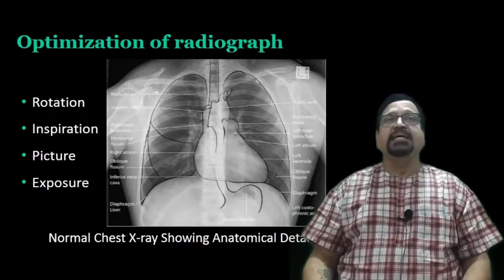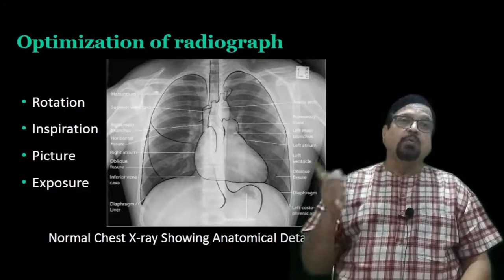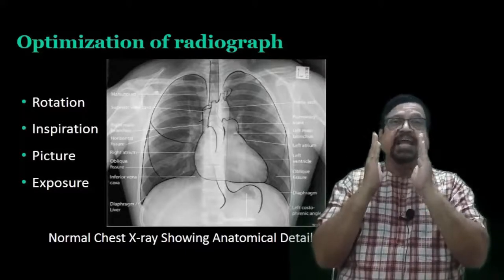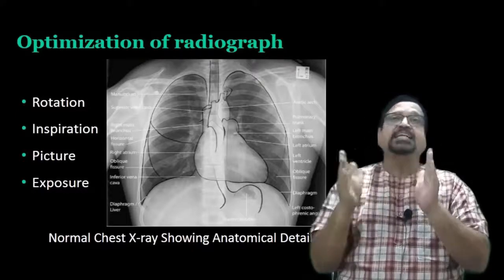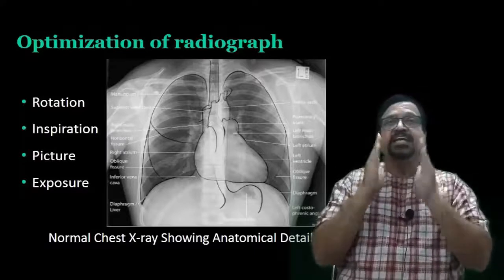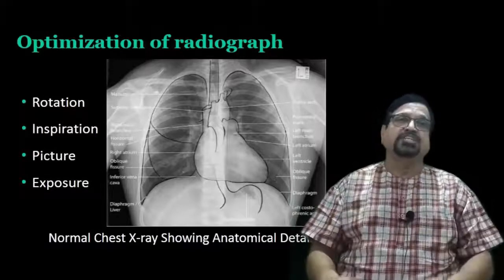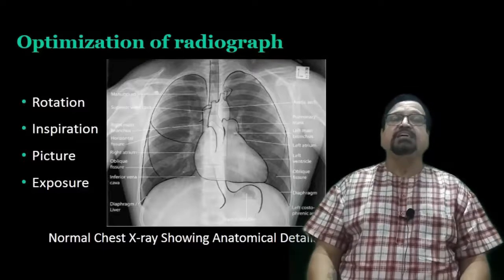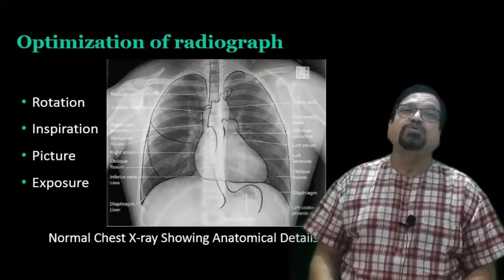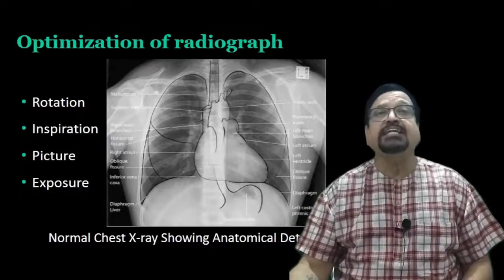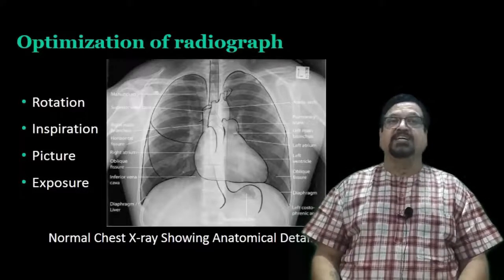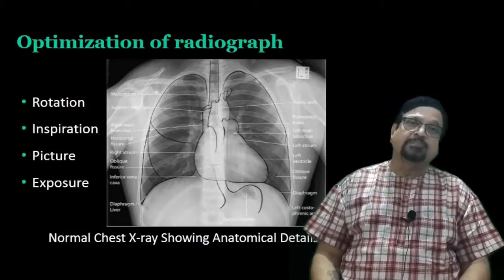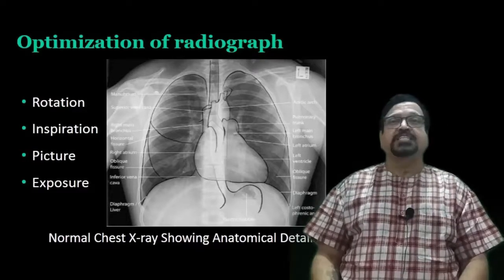Now how we have to optimize the X-ray. The X-ray can be optimized by ensuring there should not be any rotation. How we know rotation is by knowing the distance of the clavicle from the midline - the sternoclavicular end of either side should be symmetrically placed on either side of the trachea. Number two, there should be deep inspiration. The criteria are the ribs - you should see more than six ribs; eight ribs is a full inspiration. Then exposure factor is important for clarity. Cardiac borders should be sharp, vascular borders should be sharp - that means it is properly exposed. Exposure should be very short.